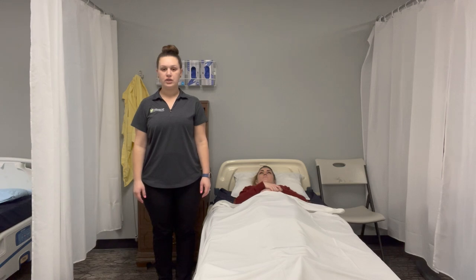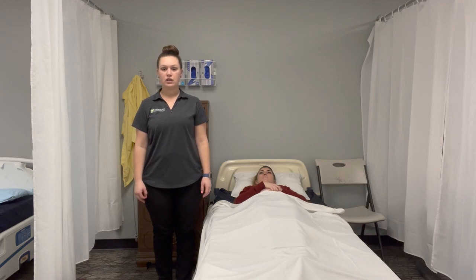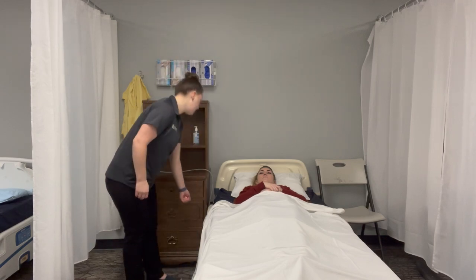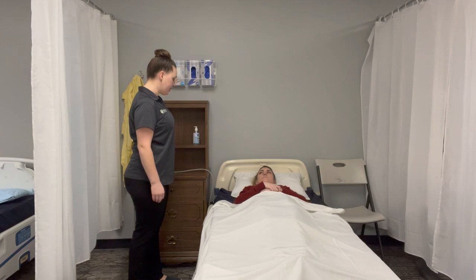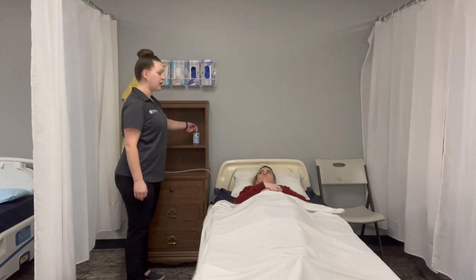I'm going to show skill number 22: assist to transfer to a wheelchair using a gait belt. First thing I'm going to do is introduce myself. Hi Allison, my name is Teresa and I'm going to help you get up into your wheelchair today. I'm going to wash my hands.